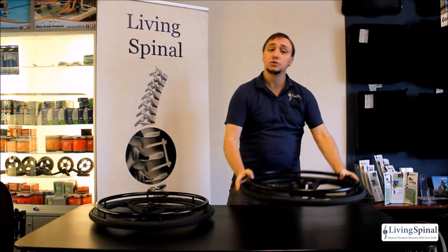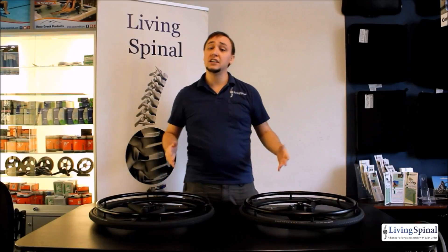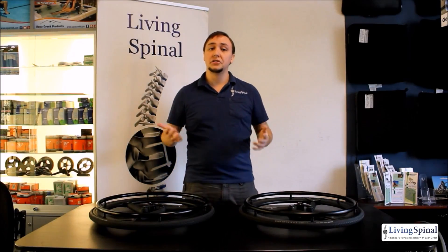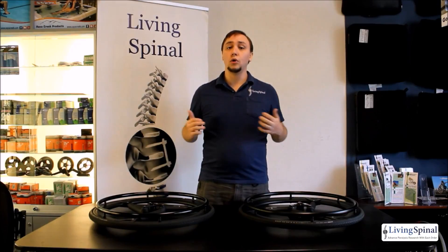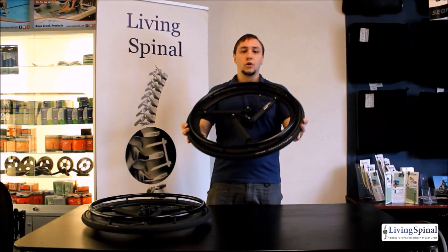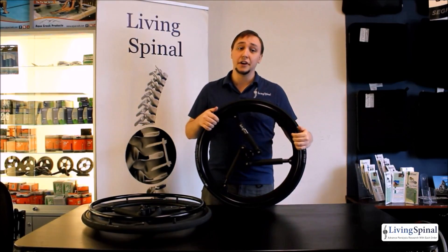Most wheelchairs feature some sort of suspension, but with the Soft Wheels the suspension is integrated, which gives you independent suspension from side to side, taking stress off the frame so that the rider doesn't feel the whole impact. The wheels are very lightweight, coming in under 4 pounds each, and all the composite components inside the hub are ultra lightweight material.